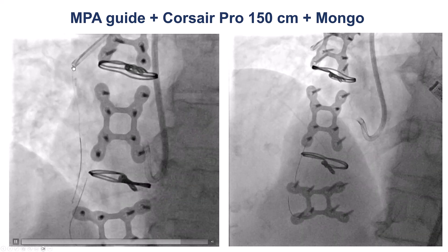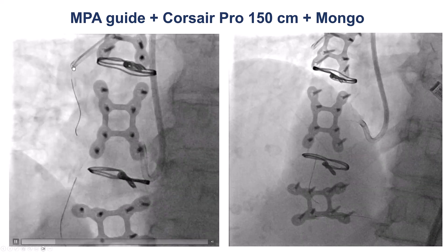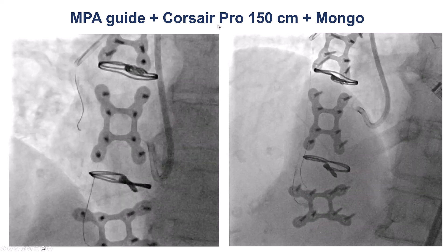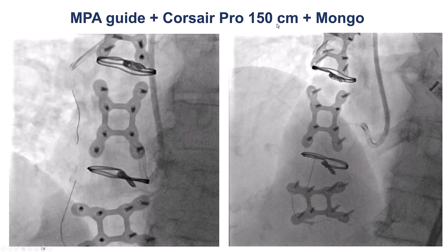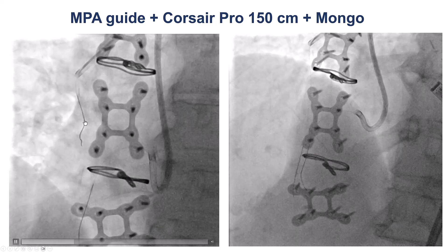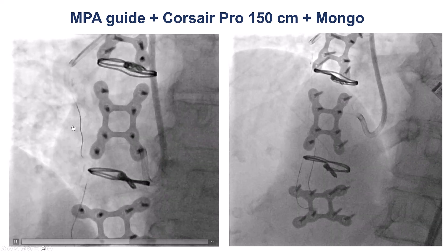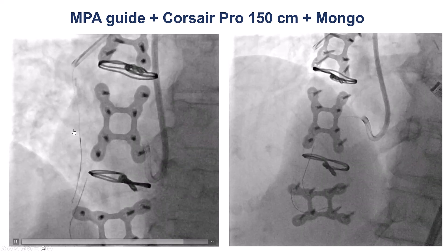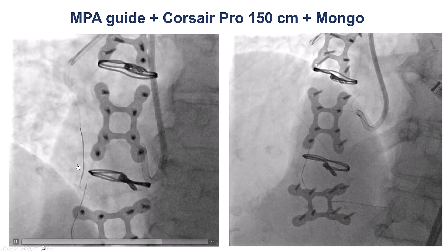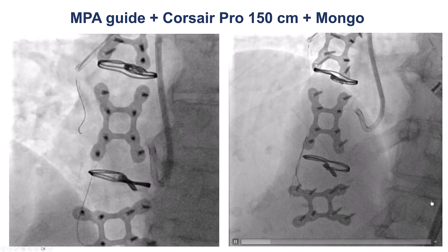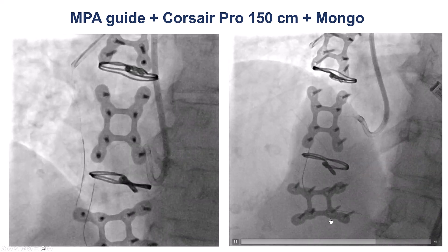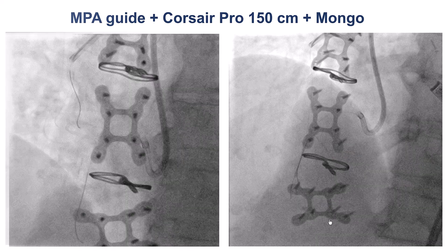The most common way for crossing vein grafts is to use a large microcatheter like the Corsair with a polymer-jacketed guide wire, and the Gladius Mongo was used in this case. Fortunately, the wire went very easily through the saphenous vein graft and advanced all the way towards the anastomosis with the native vessel.